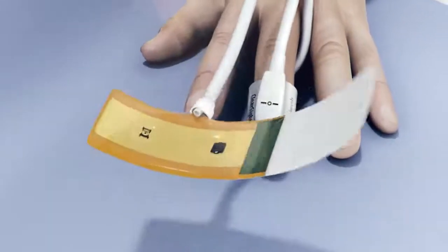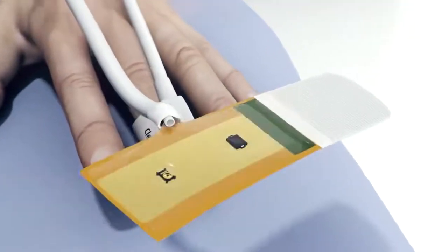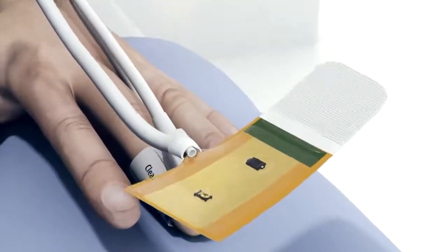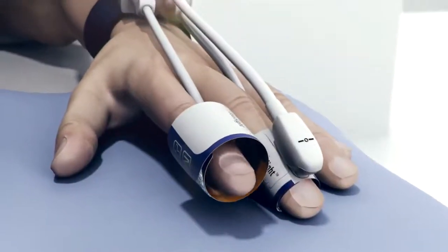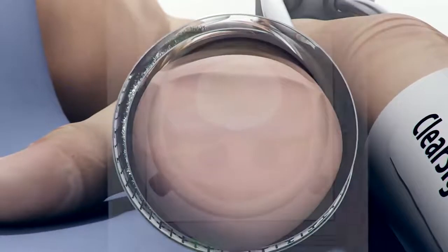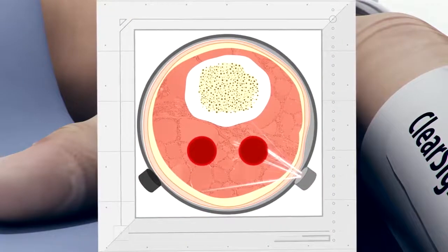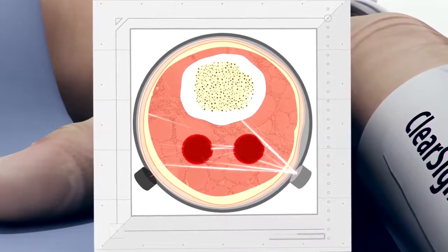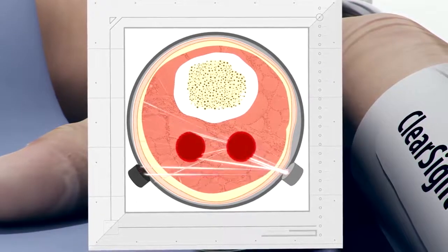Each ClearSight finger cuff consists of the following components: an inflatable blood pressure bladder, an infrared light, and a receiving light sensor. The cuff wraps safely and securely around the middle phalanx of the index or middle finger. Looking at the finger and cuff in cross-section shows that the infrared light and receiving light sensor work together to continually measure the changing volume of the arteries, which pulsate at the same rhythm as the heart.